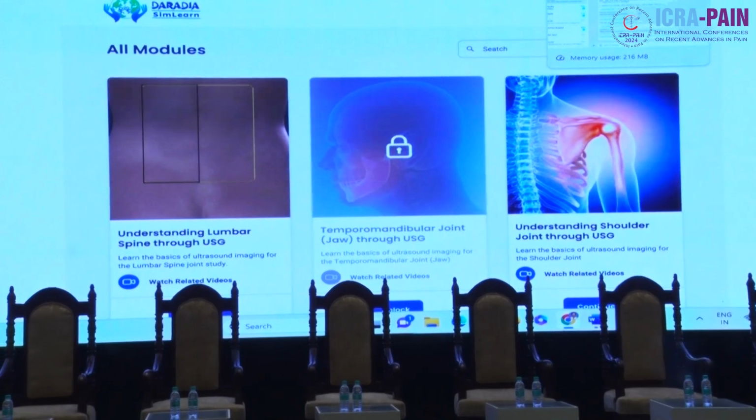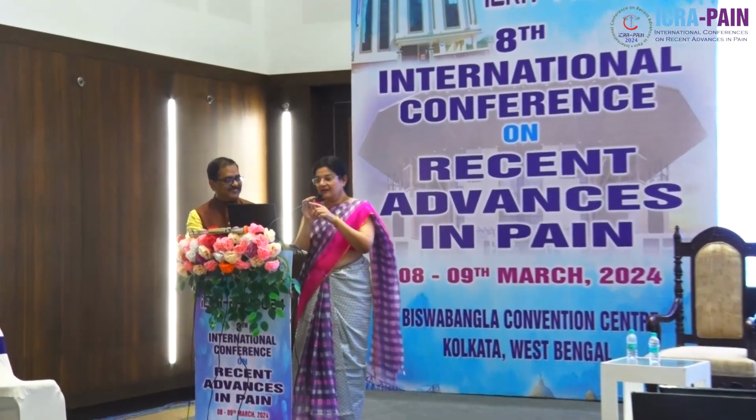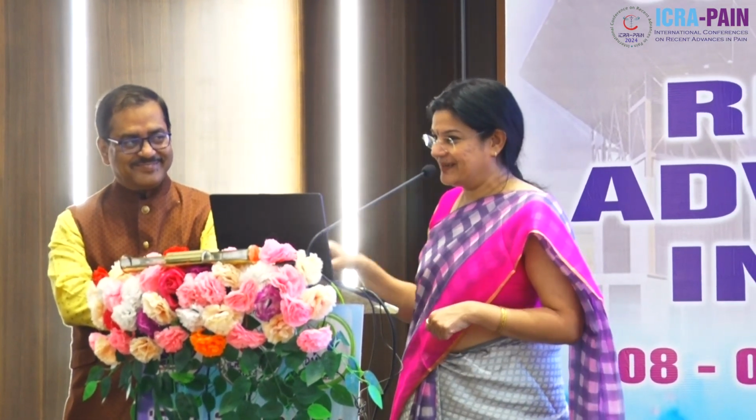Good morning, everybody. Thank you, Dr. Das, for explaining. While I was sitting down here, I figured out that we still need one more feature. Whenever we are freezing somewhere, you need to know on the picture what point it is. Because today is the first day I am attending his lecture, I am understanding what is happening. So that is a feature that I have just now discovered that we have to introduce.